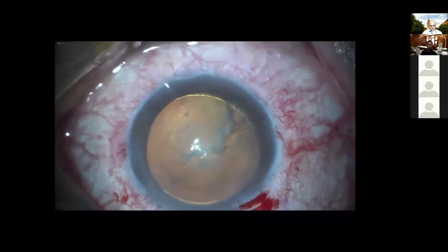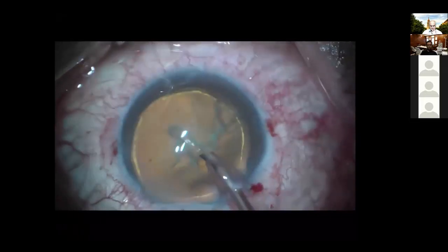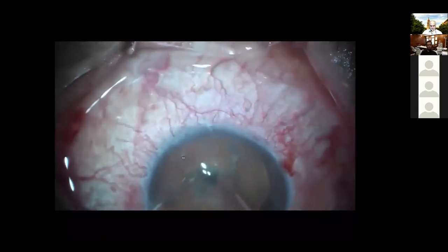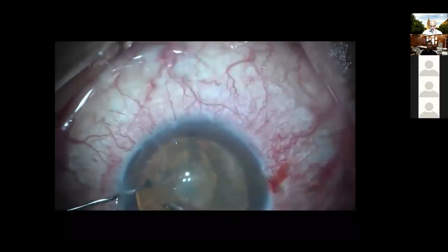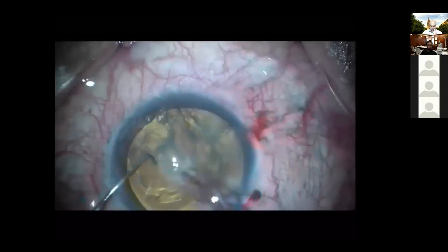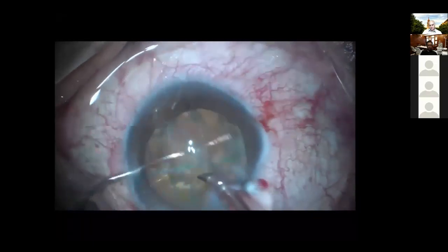Hydrodissection is done. And my current technique in phacoemulsification is phaco chop, as it is much quicker to perform phaco chop than divide and conquer. You simply grasp the nucleus from the peripheral part and then hold the nucleus and try to do your chopping. If the lens is soft, you need to go a little bit deeper to be able to do your chopping. And if it's quite soft, then sometimes you don't need to do chopping at all. You can simply remove all of the lens or nucleus without doing much chopping, as it is soft and you do not require much fragmentation of the nucleus.